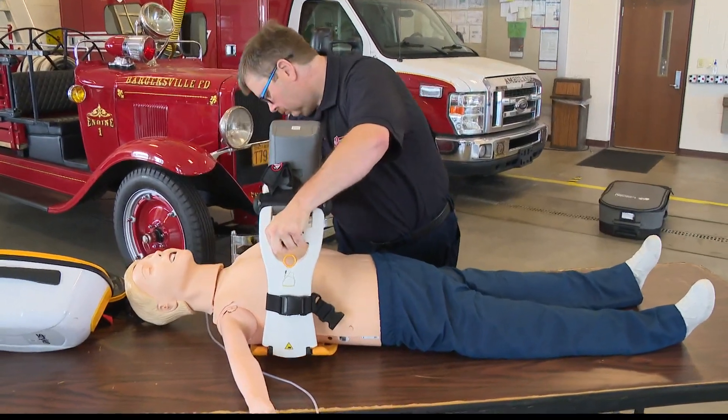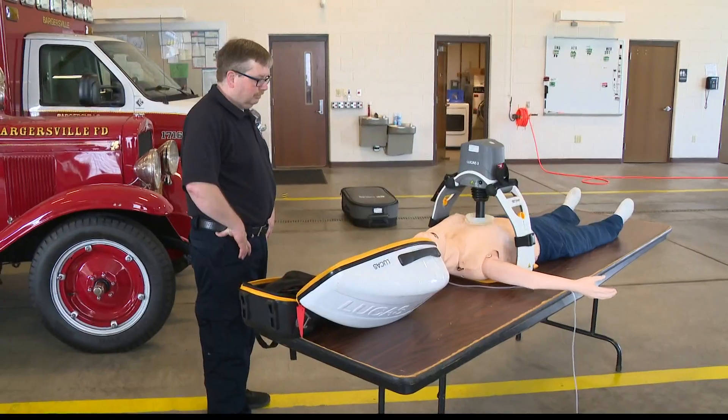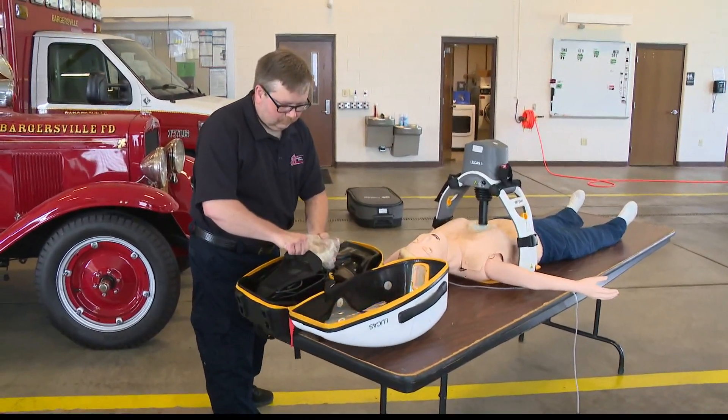Back on Sunrise, stop and take a look at this machine at work. It's called the Lucas CPR device. It's not new, but its value is really being recognized during the pandemic. Carlos was able to get a firsthand look at this and how it's actually helping first responders stay safe while still saving lives.